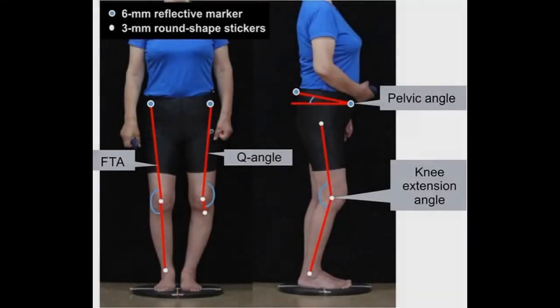Project Mockup. The idea of our project is based upon analyzing the gait variables using motion capture and force plates. As stated in the background, after recording the following anthropometric measures, shank and thigh length, ankle and knee width, we will then apply 10 reflective markers, each about 6 mm in size, on hip, ankle, knee, and foot.